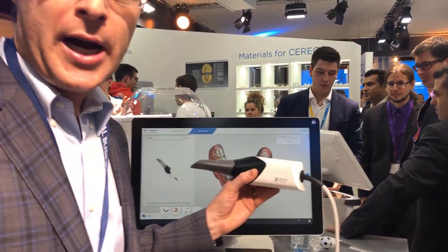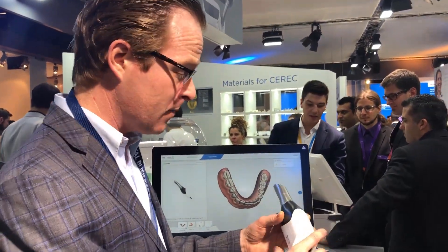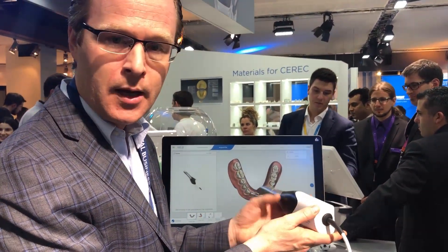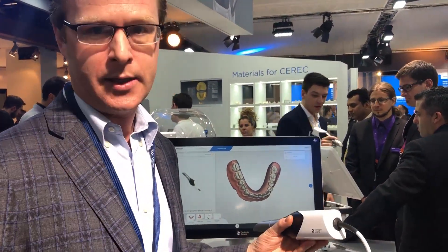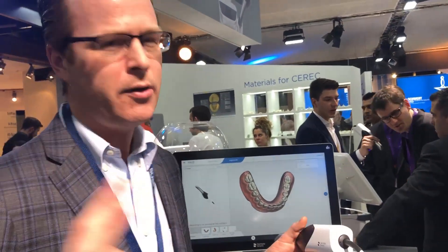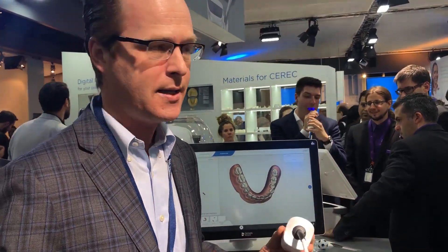The only challenge that I truly see with the Prime Scan compared to the Omni Scan is — wow! — this thing is heavy. And this is not me just being critical or saying bad things about a scanner. CEREC is an amazing system, especially for same-day dentistry. But the challenge is that if you're working with staff members that have extremely small hands, this is very, very challenging to hold, and that's just a tough thing for me to get past.